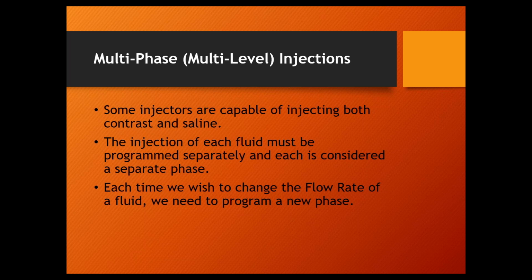A message will pop up saying, "Have you checked for air?" Now, obviously, I have nothing but air in my syringes, but if I hit yes, it's like, all right, here we go. And then there are flashing lights that indicate when you hit the inject switch, we're going to start injecting. Now, for this 2-phase shot, for CT and MRI injectors, you don't have to hold down the inject switch. You just hit the button and it goes. So we're going to start the injection.